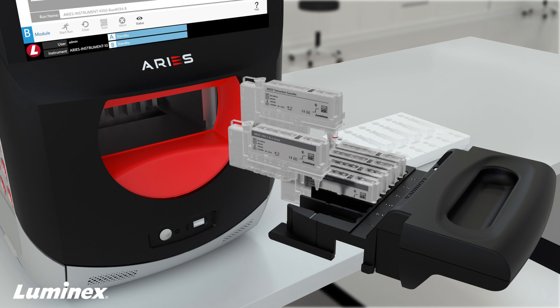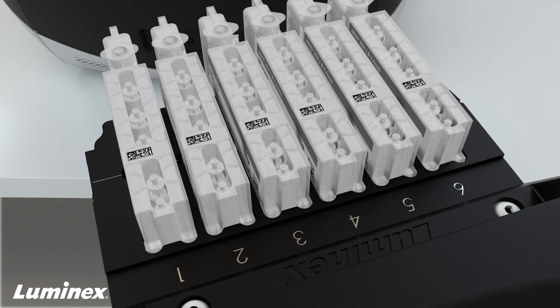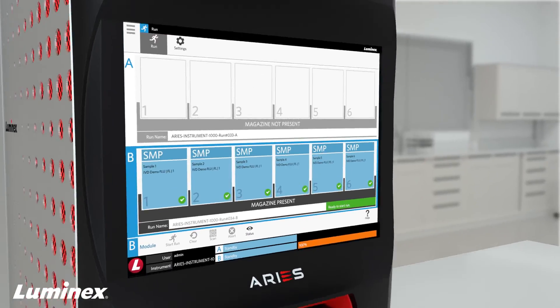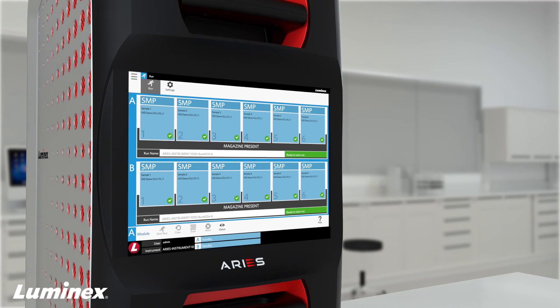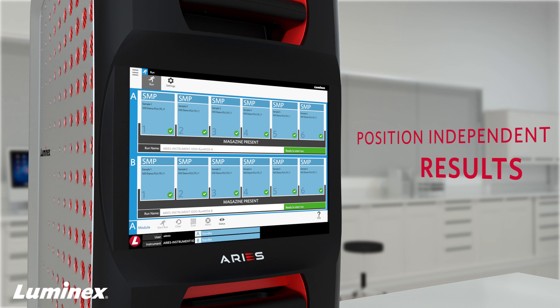Ares can help you consolidate assays into a single magazine and reduce turnaround time with stat and random batch testing. Ares internal barcode scanning matches samples to cassettes, enabling position-independent results and improved result accuracy.